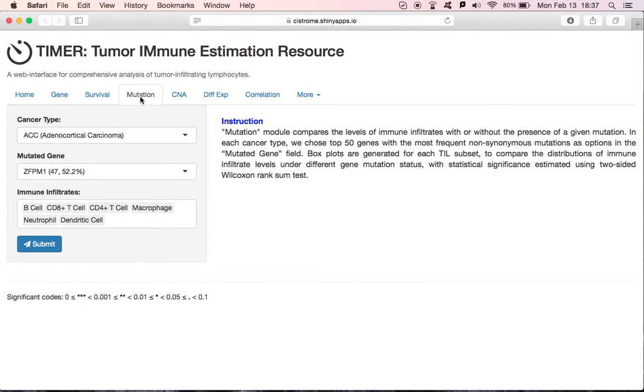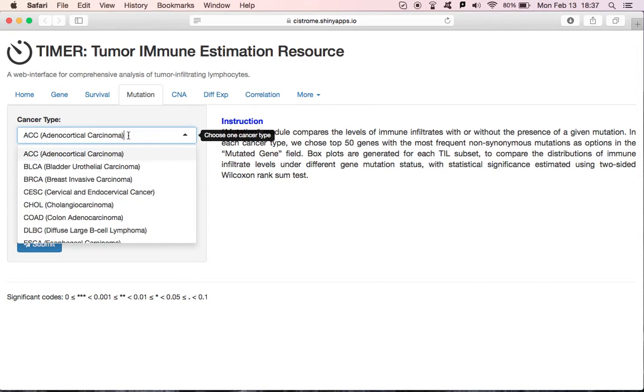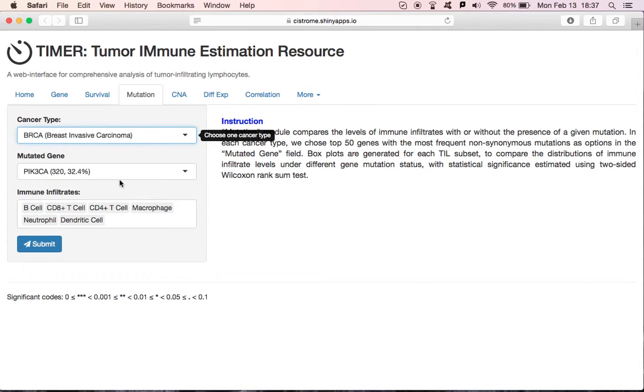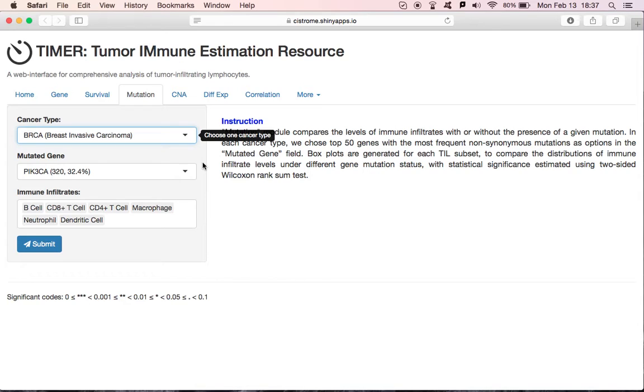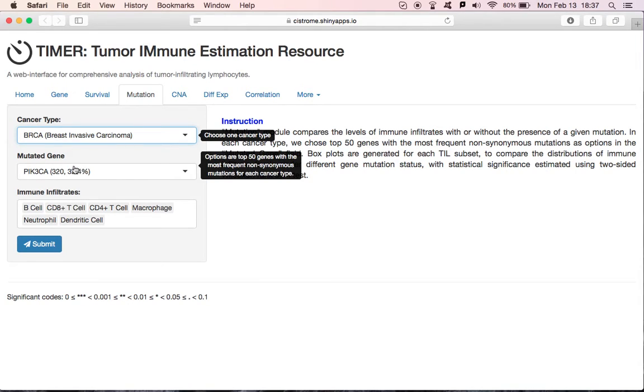This module compares the levels of immune infiltrates with or without the presence of a given mutation. Here, we choose breast cancer, and you'll see the mutated gene list has changed. Then, choose a frequently mutated gene. The first number in the bracket is the number of patients with this mutated gene, followed by its percentage.